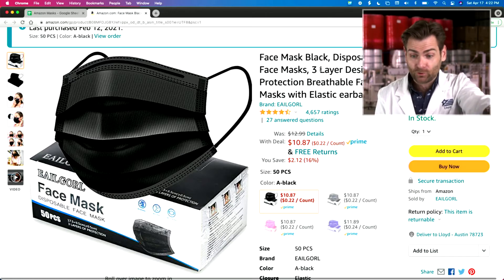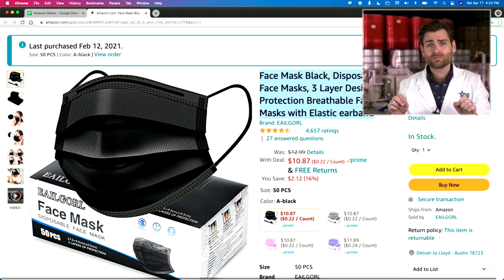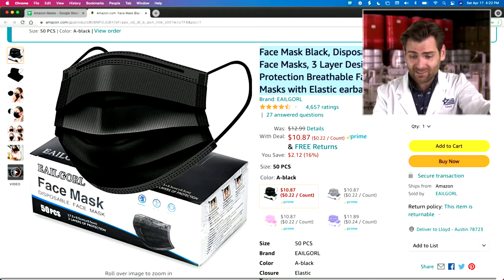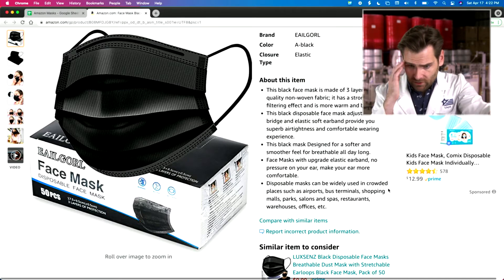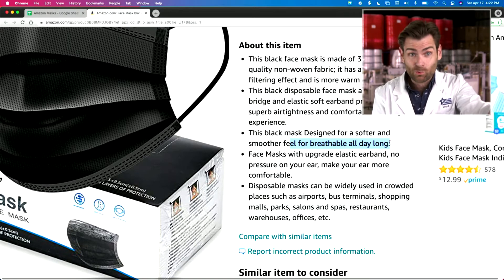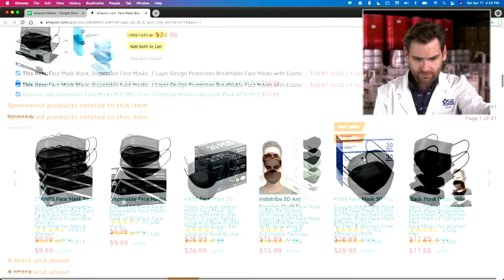Let's look at this mask listing: black disposable, three layer design, elastic ear band. They took all of the keywords for face masks, put it in a blender, and put it in random order. 4,600 reviews, $10.87 — pretty good price. They've got a bunch of different colors; we've got the black ones. This black mask is designed for a softer and smoother feel, breathable all day at 51 airflow resistance. They are not wrong — that is super breathable. Our masks are anywhere between 110 and 130, depending on how they feel that morning.